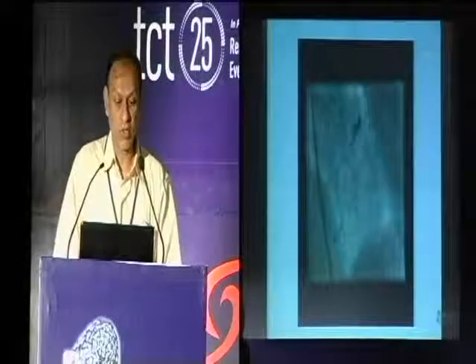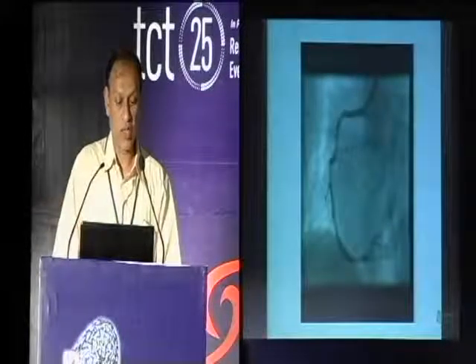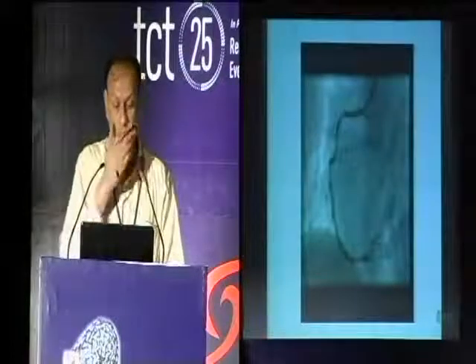We wired the lesion, we did a plain balloon angioplasty, the mid RCA, plain balloon angioplasty in the distal RCA, and here we are coaxial. Look at this angle between the RAO 30 view. The guiding catheter and the vessel are coaxial. We did a stenting of the mid RCA.